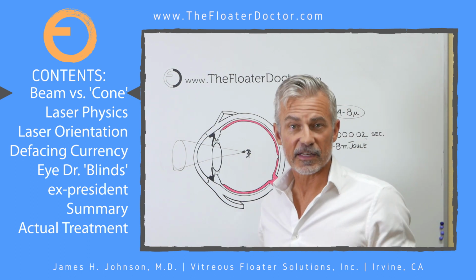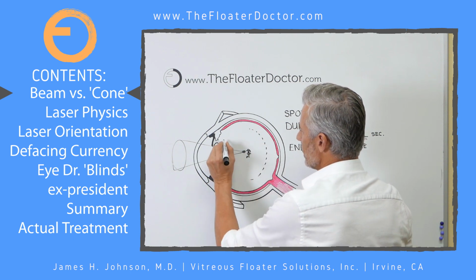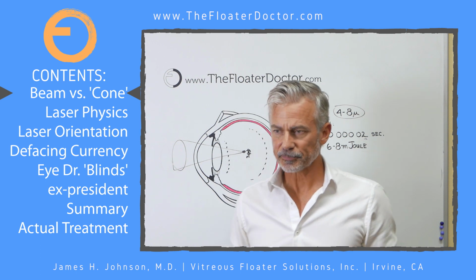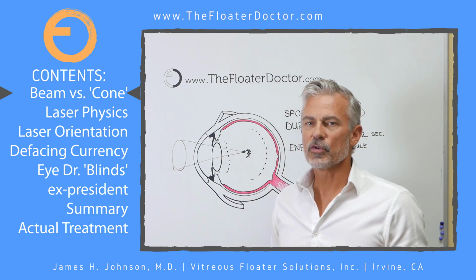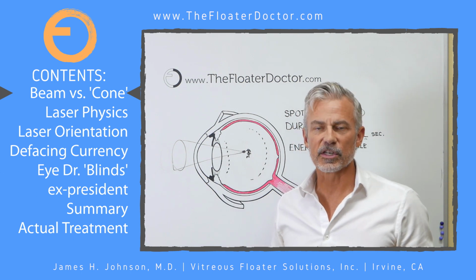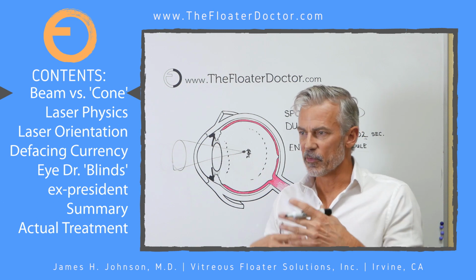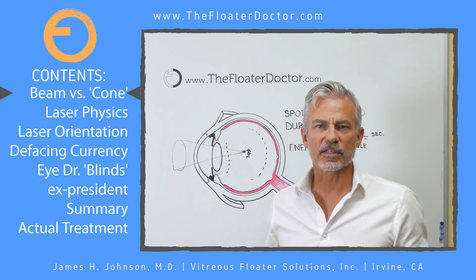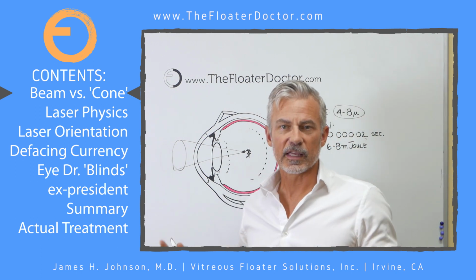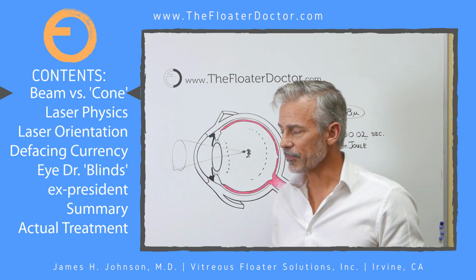Now I have responsibility, I need to know where that is, and I also need to keep it safely away from the retina, keep it safely away from the lens. When you do that, with experience and good judgment, you can keep the risks of injury to the retina and the lens statistically approaching zero. Very, very, very low. And when people hear about a laser in the eye, they're thinking worst case scenario. What's the worst case scenario? Well, the worst case scenario is avoidable by keeping the energy away from these critical and important structures.